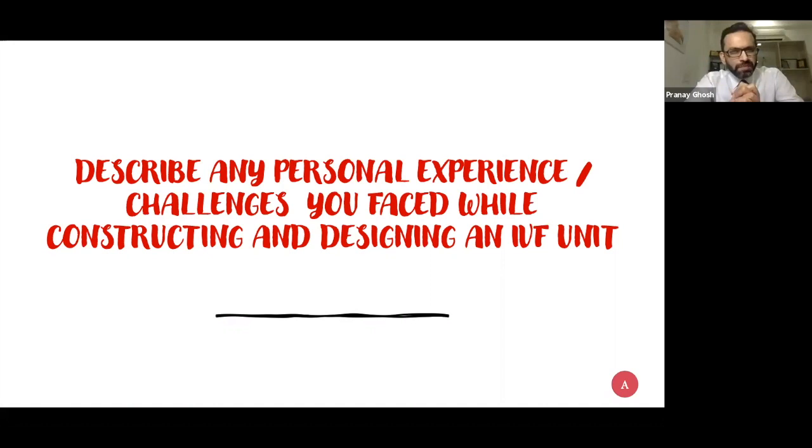we should not be complacent regarding quality control. After we have bought a piece of equipment, I'm especially talking about Indian setups, single clinician ownerships, they have invested a lot in their equipment, but they are dependent on the people who are doing installations for the installation and the operational checkups. And I've found, at least in one of the facilities, right after starting, we had a spate of high miscarriage rates. And eventually we found that the stage temperature of the incubator, even though it was certified to be fine, 37, 37.5 by the installation check done by the engineers, was found to be 32 degrees.